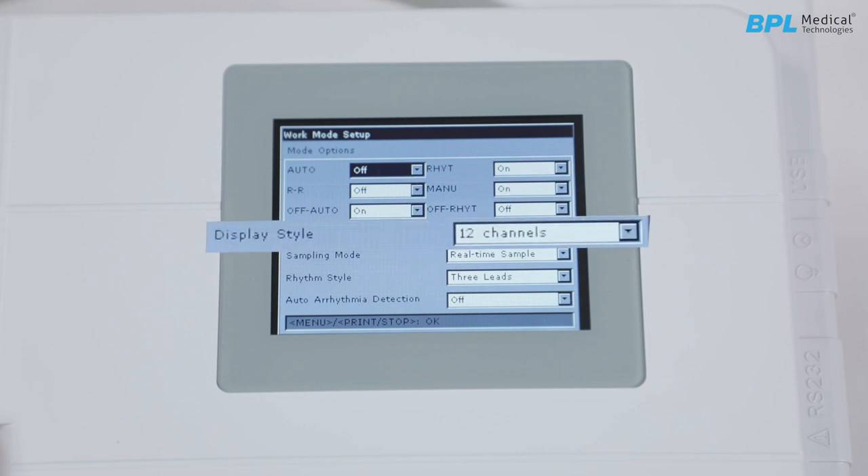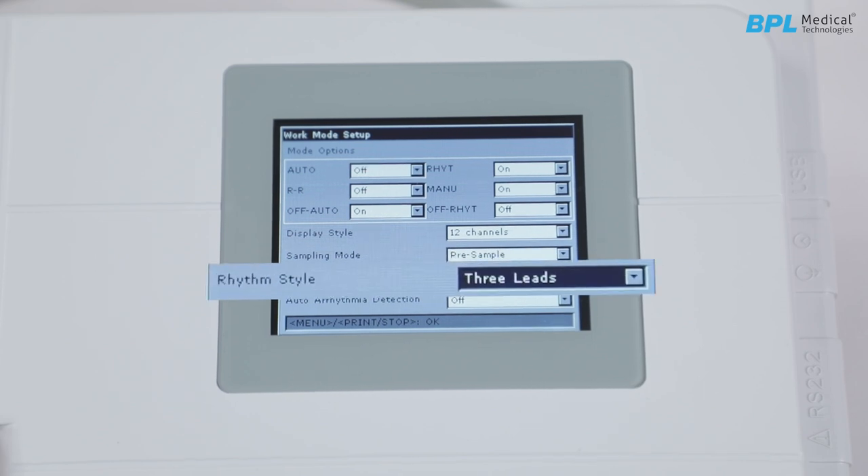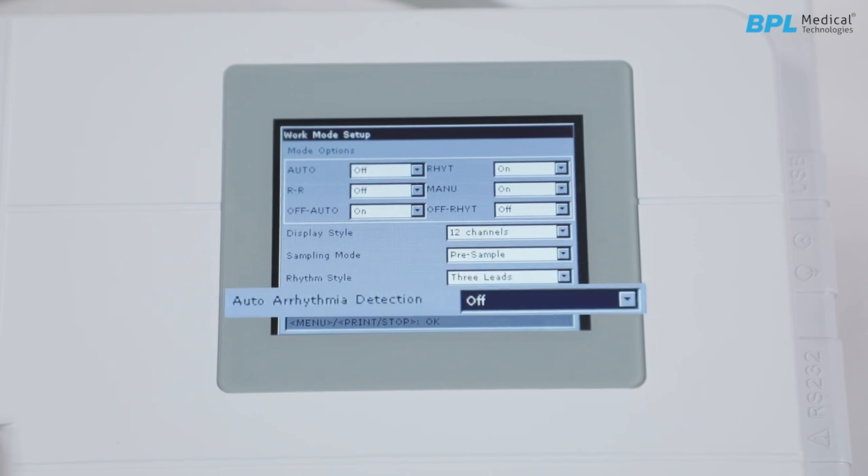Next is auto display style — the format of the ECG waveform you would like to configure on the display screen. Sampling mode: pre-sample mode prints 10-second ECG data sampled before; real-time sample prints out live data. Then is the rhythm style, where auto arrhythmia detection can be enabled or disabled.